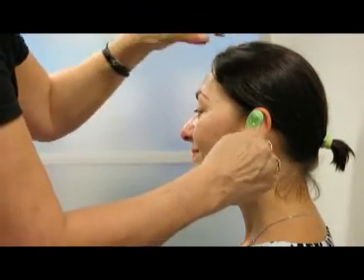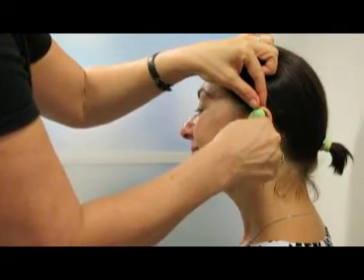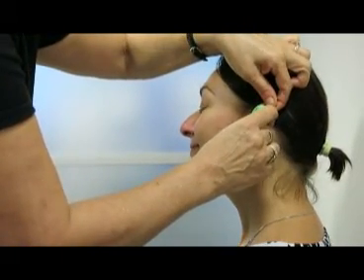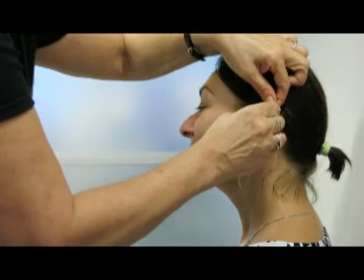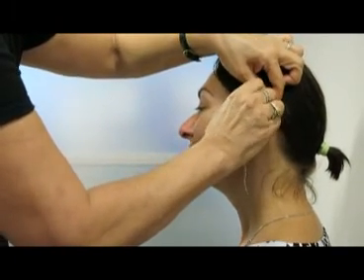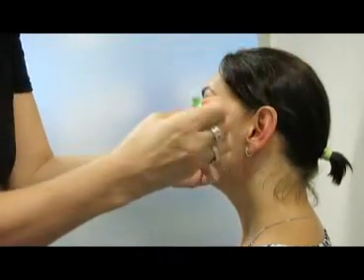To see if the impression is ready, I just put my fingernail in there and it doesn't give, so I know it's ready. Then what I do is I just pull on her pinna just a bit to release the lock and twist it forward and pull it out. And there you go.